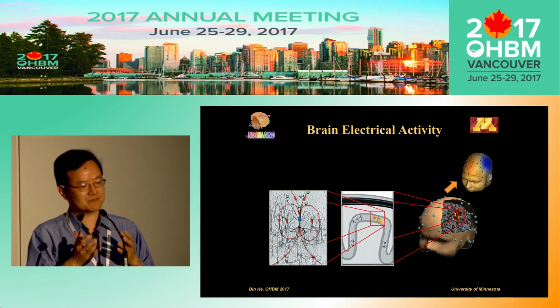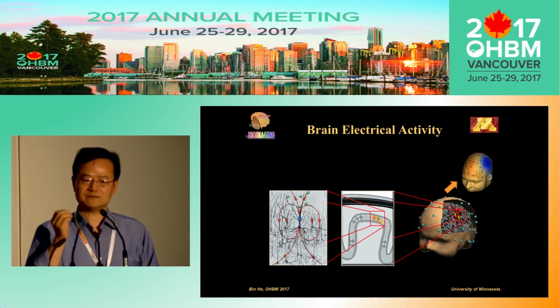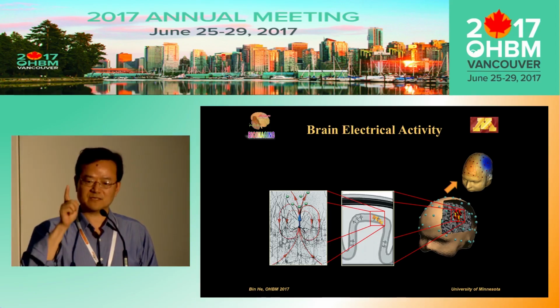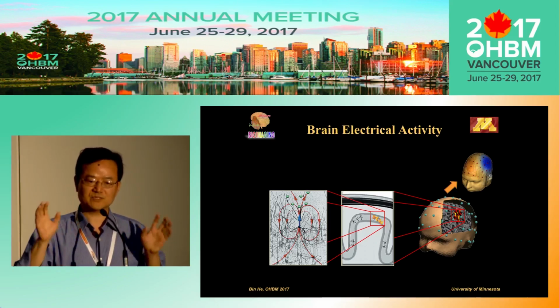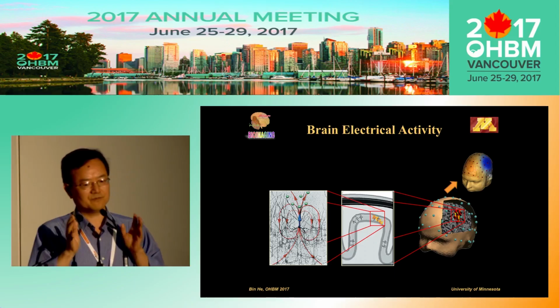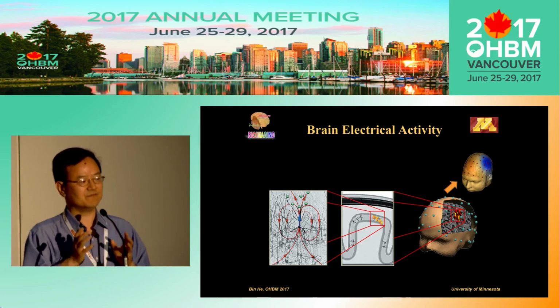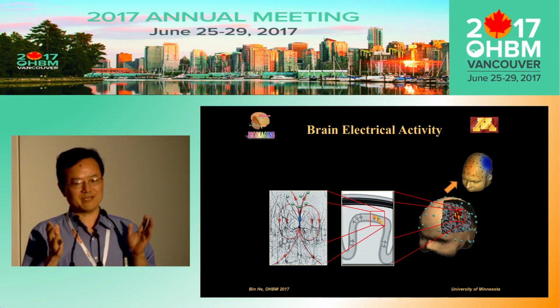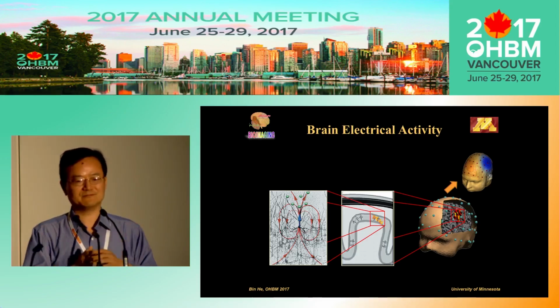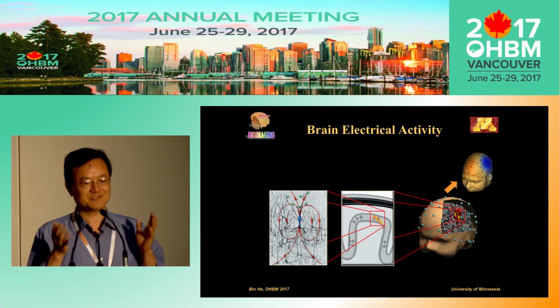And this is one of the arguments I really enjoy a lot. I have been speaking in a National Academy workshop to say that sometimes people argue that EEG or MEG does not reflect single neuron activity. So my argument to this broader community, I told the core audience, yes, if you want to image a single neuronal excitation non-invasively, EEG and MEG is not a solution. And even if there is a solution, I believe there is no solution at this time in this world.